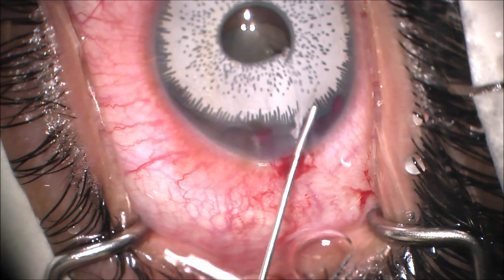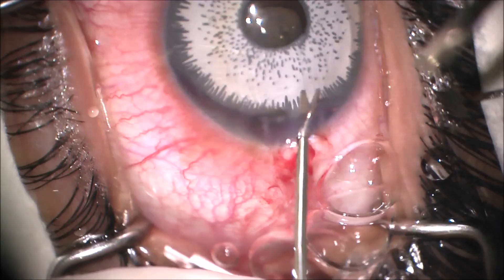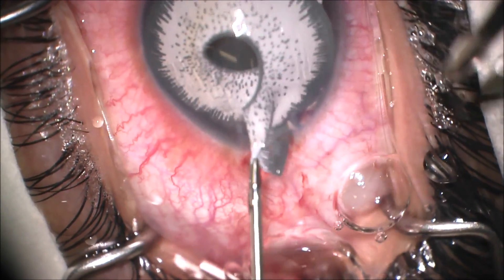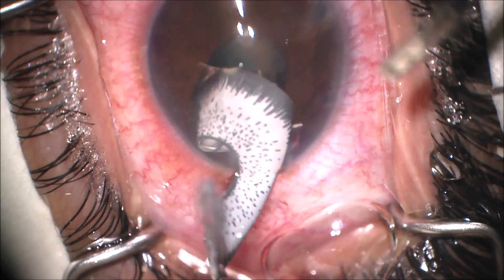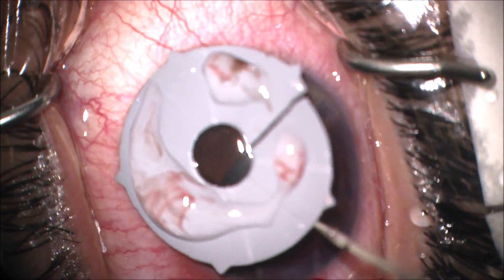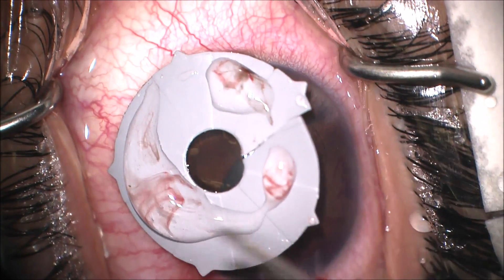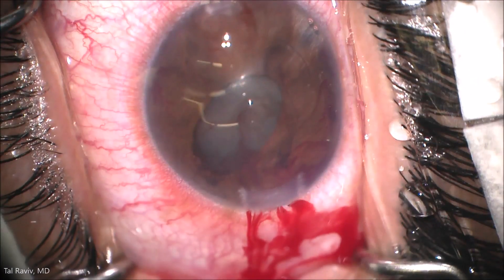Next, some more dispersive viscoelastic is placed. A micro grasper is used to get a hold of an edge of the implant, and it is explanted atraumatically. When looking at the implant, we can see the five footpods which are meant to hold it in place, but indeed cause much of the damage because they can't be sized properly.